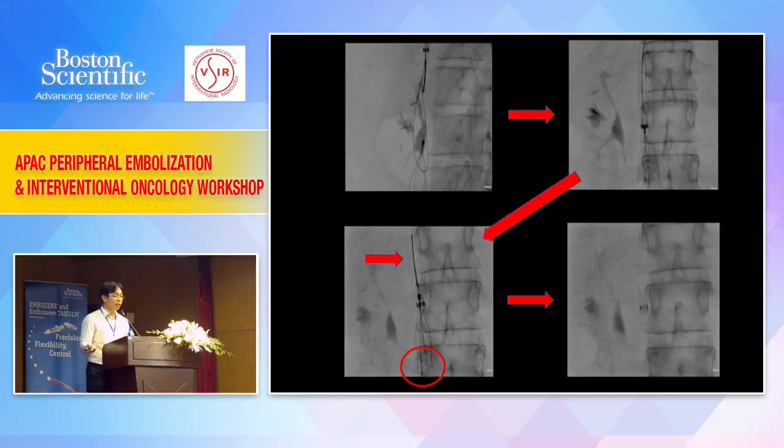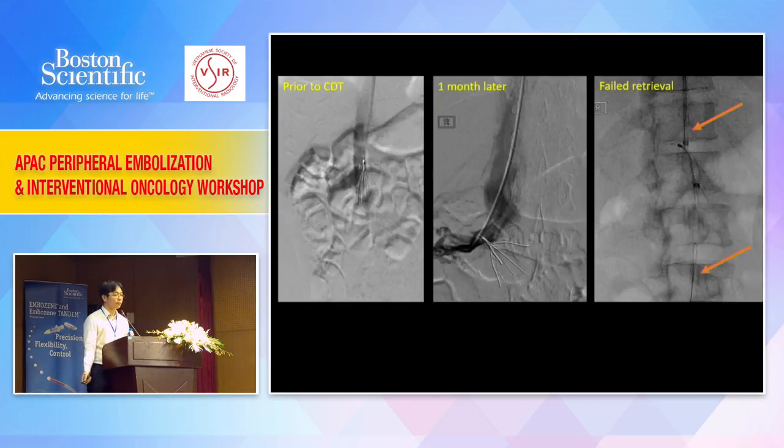Pull and yank, and you can see in the third picture, the one at the bottom left, the tension in the snare. You can see how the leg refuses to close, and then finally with a sharp yank, and you really have to have a big gallbladder, which means you've got to be very courageous, you just yank and you pull out the filter.